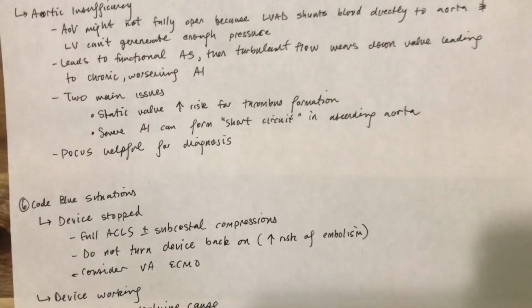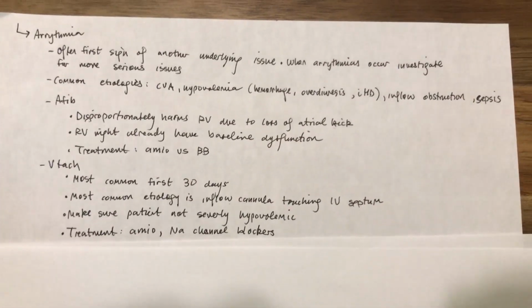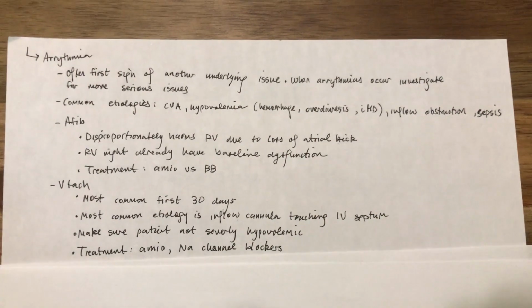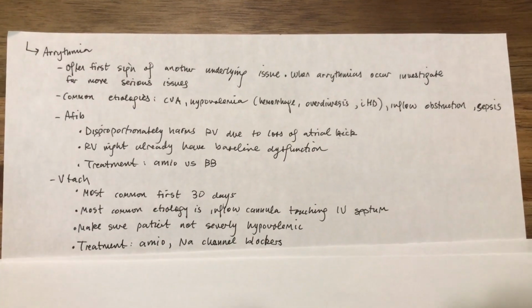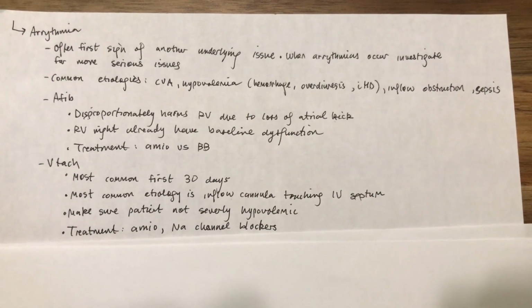All right, and we'll keep going on to arrhythmias. We're almost done. So the first sign: arrhythmias are often the first sign of something else going on. And this is different from other populations of patients.